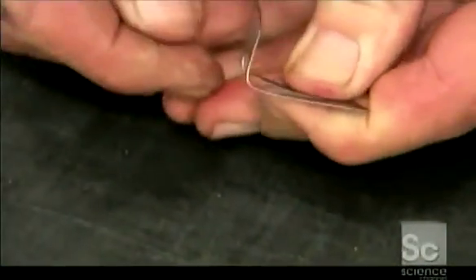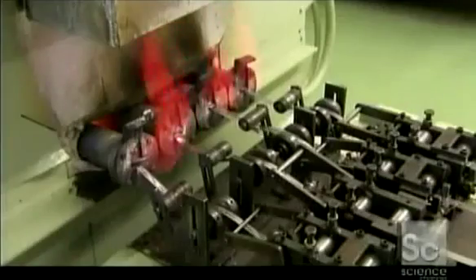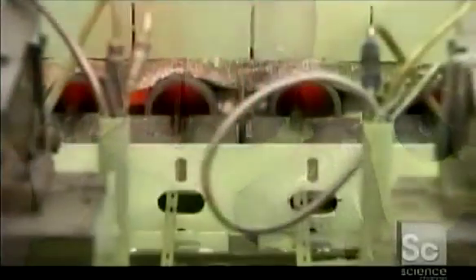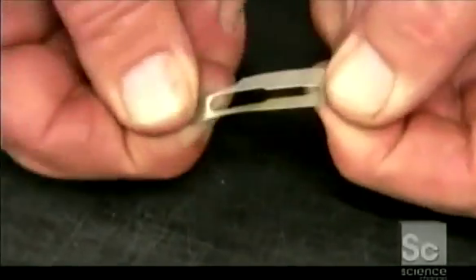When you flex a blank, it bends entirely out of shape — that's because the steel still needs to be tempered. The blanks pass through a furnace for about thirty seconds. The heat alters the molecular structure of the metal, hardening it. Now the blank has the flexibility a scalpel blade requires.